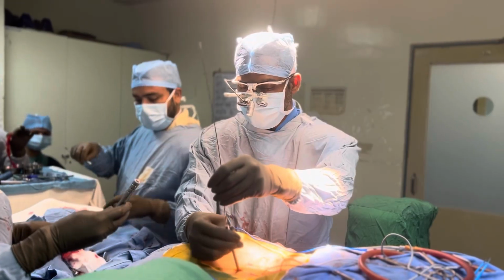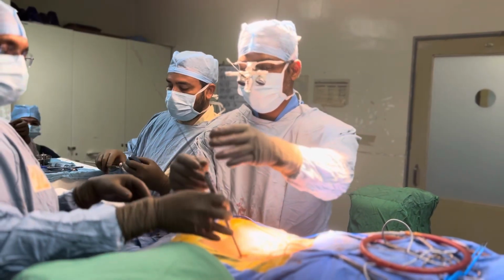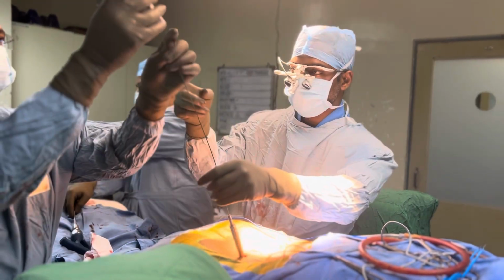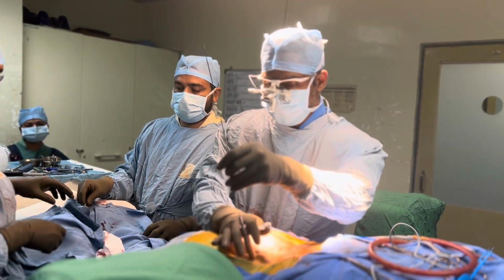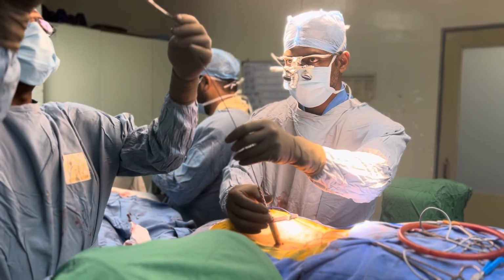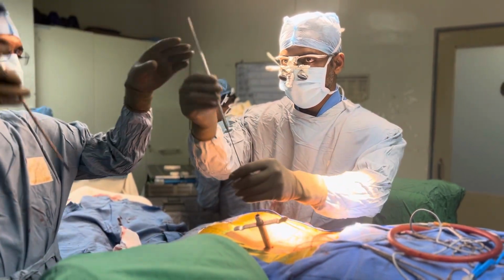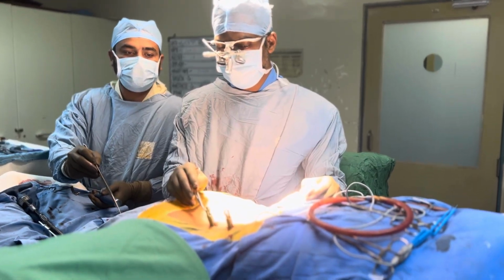Left side screws and rod are already placed. Now I am putting the right side screws from the left side only. There is no need to go on the right side because all the time I need to see the screen of the C-arm image intensifier. So I am standing on the left side only and the screen is on the right side. So I am going to put the right side pedicle screws from the left side only. Now both right side pedicle screws are placed.